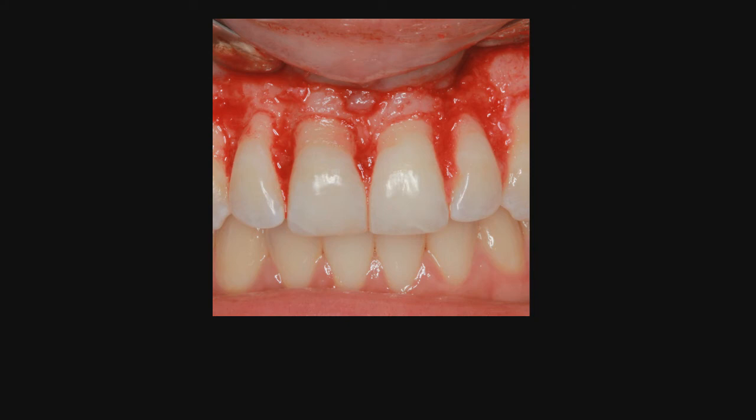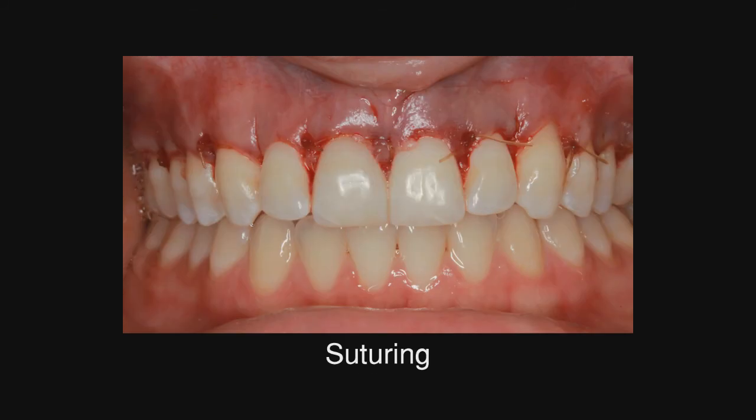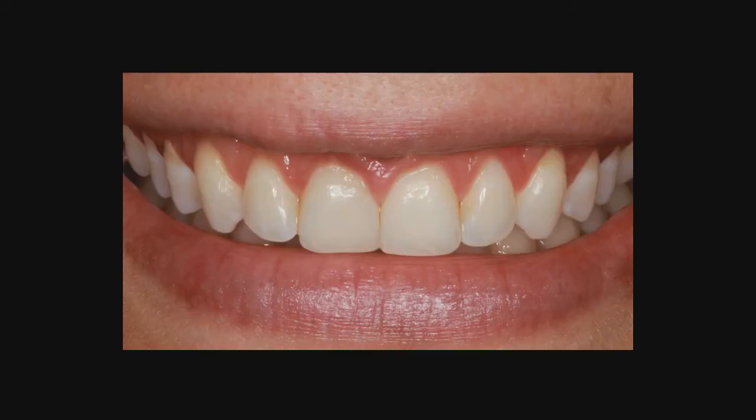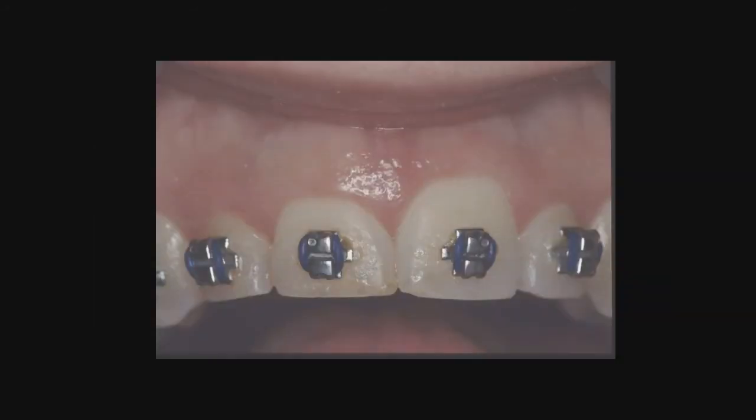So here we see the final osseous surgery, and remember, when the contact point is 5 millimeters or less from the crest of the bone, Tarnow has told us the soft tissue fills the embrasure space 90% of the time, and you will see that Dr. Mantor did leave the 5 millimeters there. So here we see the suturing, and this is the way the case looked post-operatively. So this is where we started, and this is how it looked post-operatively, and a very nice aesthetic result. Congratulations, Dr. Mantor.